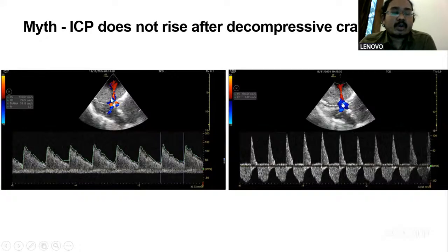By virtue of osmotherapy and sedating the patient, taking care of all other variables, we again got normal waveforms with a TAmax of 74, but this time a pulsatility index of 1.31. And by evening 7:55 of the same day, again we got a reversal of diastolic velocities. Now we call this oscillating waveforms.